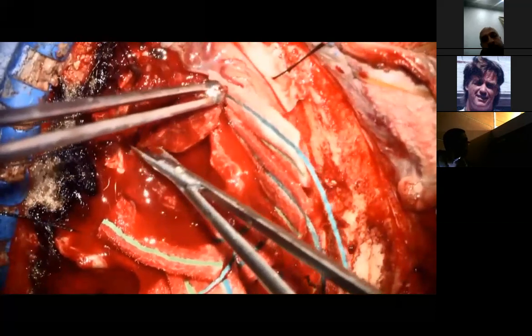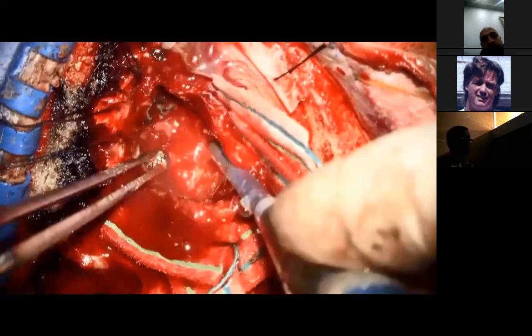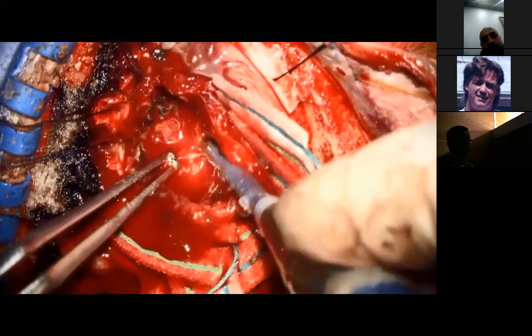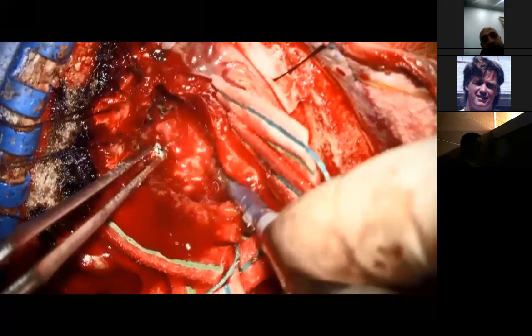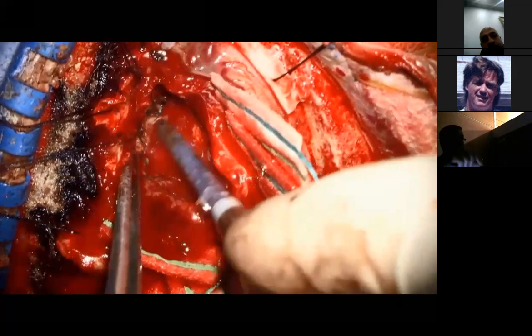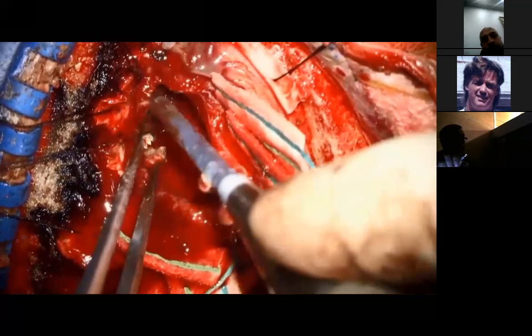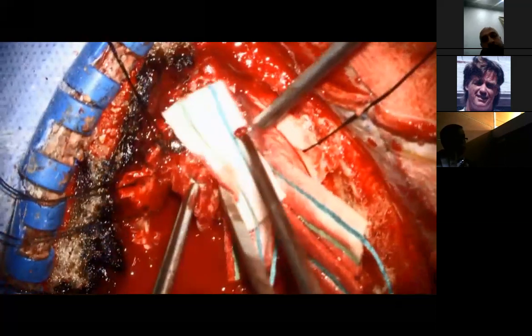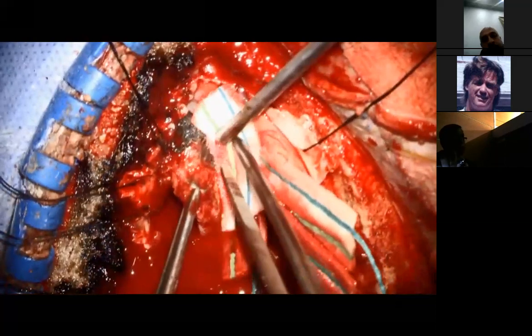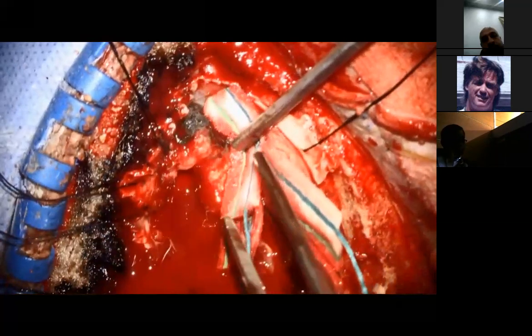So piece by piece, there's nothing called one-piece surgery. Like the old neurosurgeons used to do, they put their finger and they just chop the tumor out. On their fingers, they will have billions of neurons. Again, you can see the vessels separating the tumor from the brain.